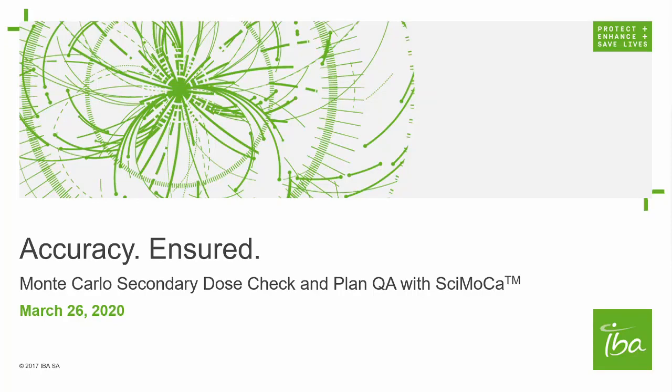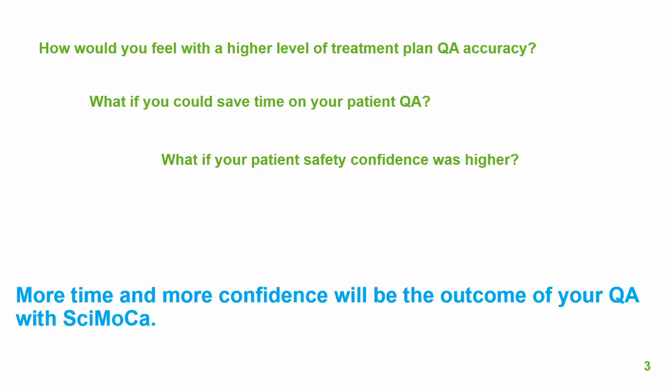I'm Anthony Nagel, and I'm happy to have this opportunity to present SciMoCa, the Monte Carlo-based secondary dose check and plan QA software. But before we get into SciMoCa, I'd like to ask you a few questions.